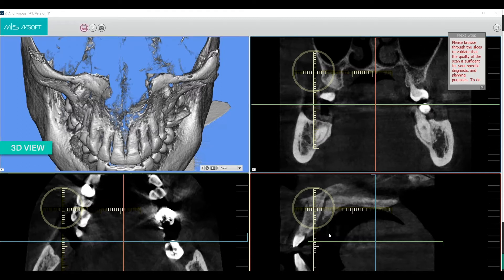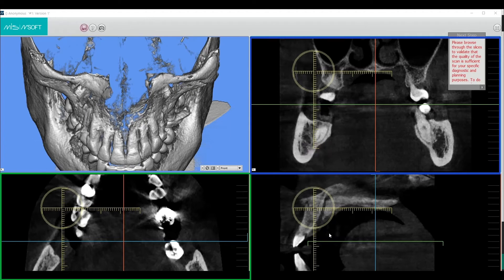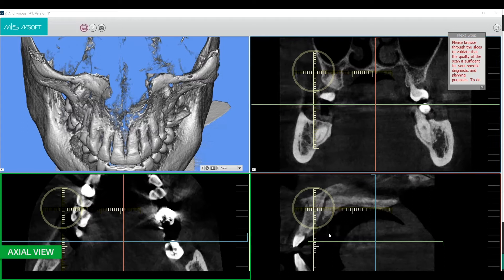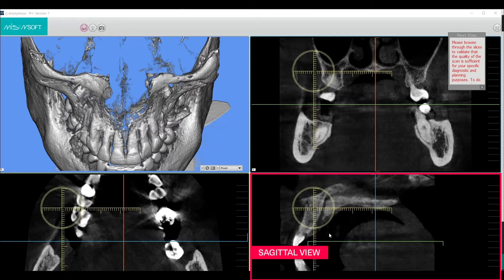In the upper right, the frontal view is represented by a blue frame. In the lower left, we can see an axial view, represented by a green frame, while in the lower right, we have the sagittal view, represented by a red frame.